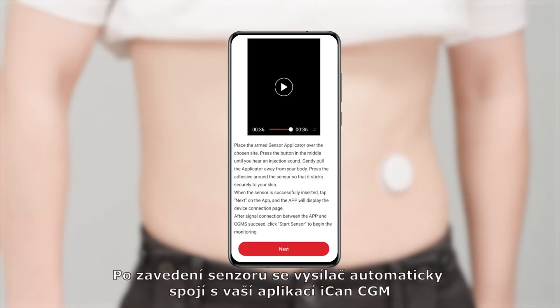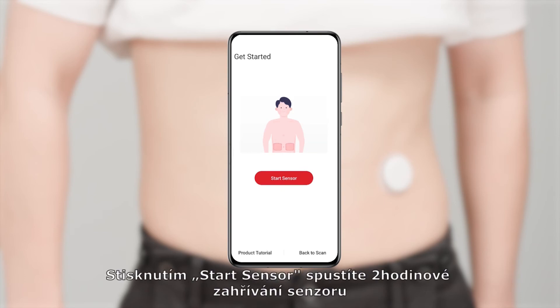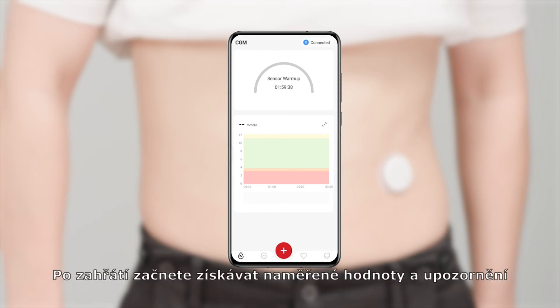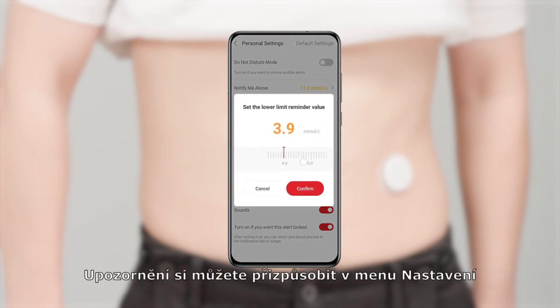After inserting your sensor, the transmitter will automatically connect with your iCan CGM app. You need to press Start Sensor to enter into your two-hour sensor warm-up. After the warm-up session, you will start getting readings and alerts. You can customize your alerts under menu settings.